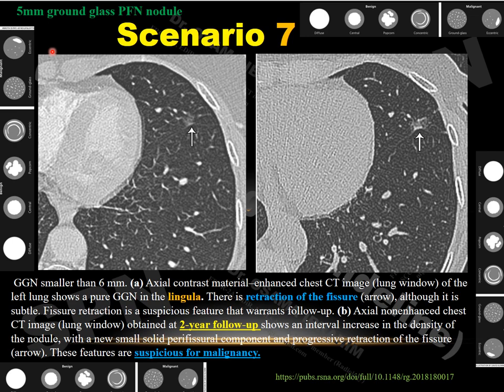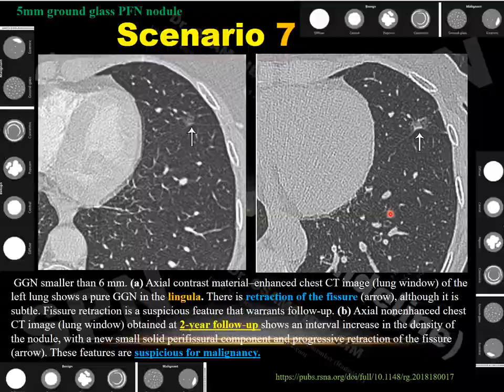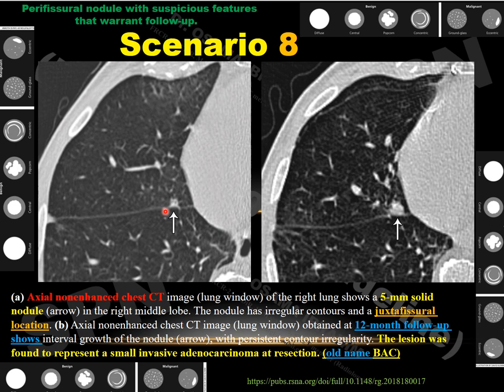Scenario 7: A 5 mm perifissural nodule with ground glass opacity and irregular outlines. At two-year follow-up, increased nodule density, soft tissue component at the fissural side, and distortion of the fissure were noted — highly suspicious for malignancy. Scenario 8: A juxtafissural nodule of approximately 5 mm in the right middle lobe. At 12-month follow-up, it increased in size and density with irregular, spiculated outlines. Histopathology confirmed small invasive adenocarcinoma at resection.